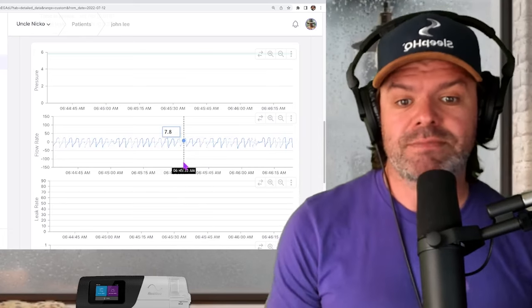I'm pressing X on the keyboard to zoom out so you can see this pink line moving around. As the pink line gets closer to one, it means there's very severe flow limitation — limiting the flow of oxygen into your lungs due to a restriction in your upper airway. It might not be a full 50% or more restriction required for a hypopnea classification, but there can still be a restriction that limits airflow. As the pink line gets closer to zero, breathing is more normal. Here in this section, the flow limitation moves up towards 0.78.